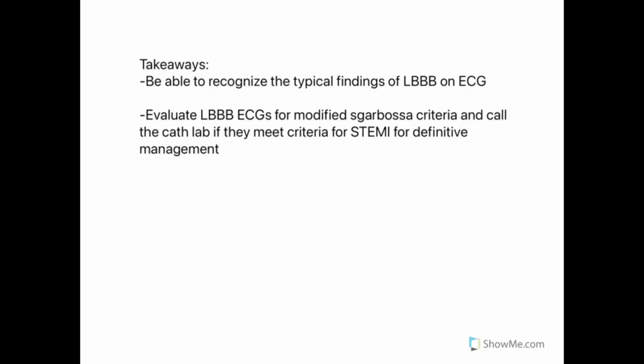The takeaways for this week were to be able to recognize the typical findings of left bundle branch block on EKG and to evaluate left bundle branch block EKGs for modified Sgarbossa criteria and call the cath lab if they meet criteria.